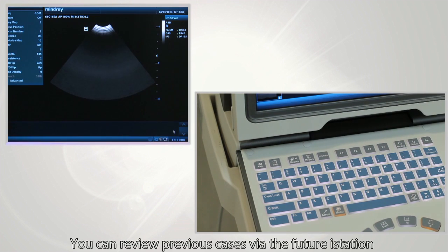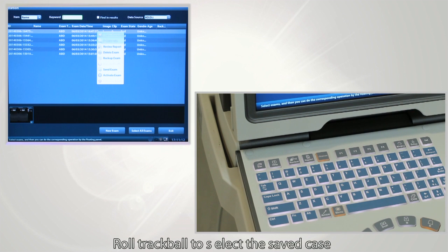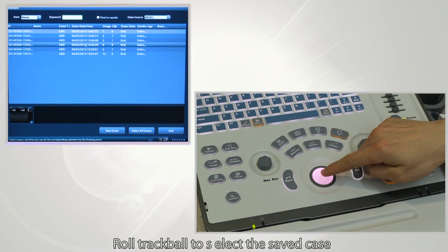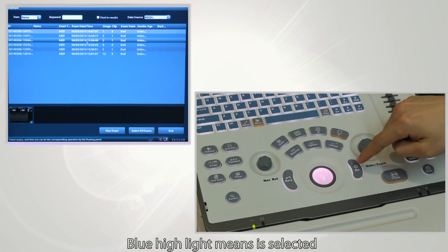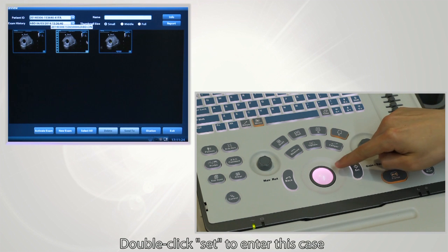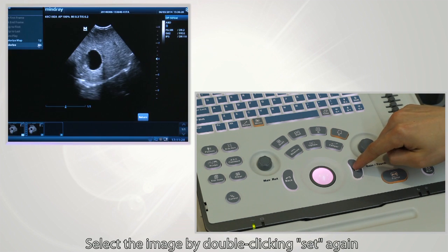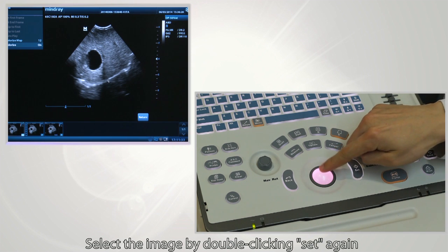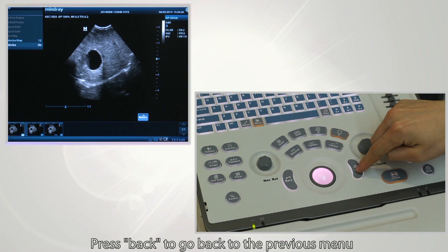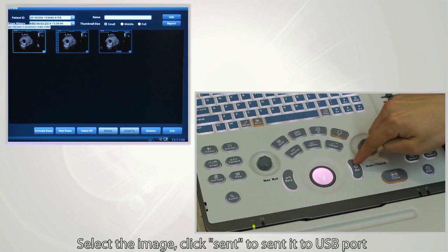You can review previous cases via the iStation feature. Roll the trackball to select a saved case. Blue highlight means it is selected. Double-click Set to enter the case, then select the image by double-clicking Set again. Press Back to go back to the previous menu and select the image.